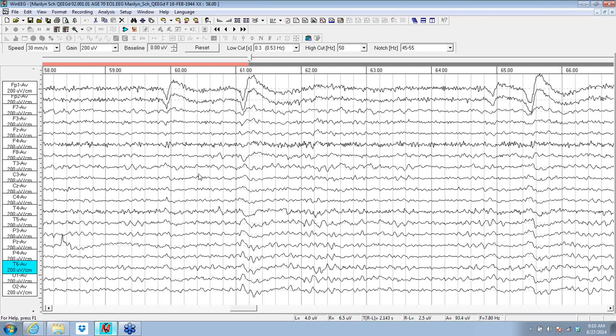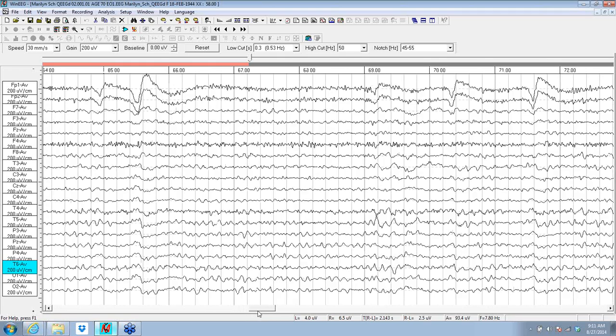And in our lab, these are generally described in the following manner, that though these findings may be seen in asymptomatic individuals in this age group, temporal slowing is generally thought to be associated with cerebrovascular insufficiency. So what we've seen only when we get to the correct montage is that we've got a clinically significant pattern of independent temporal slow waves, right and left side.